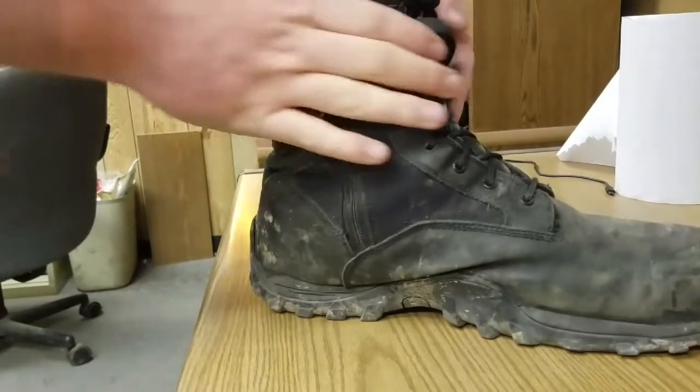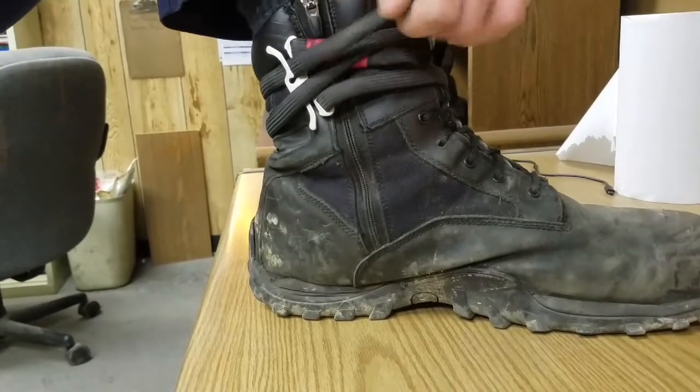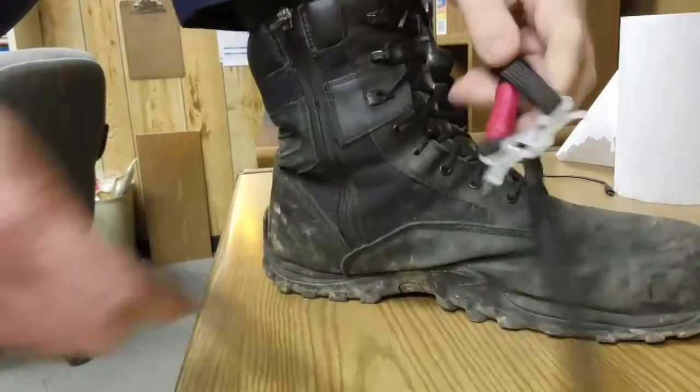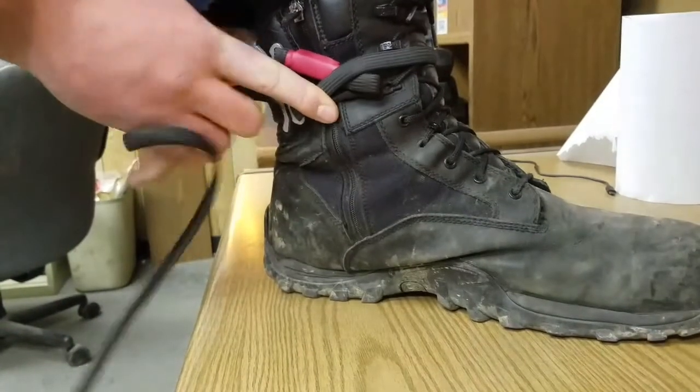For rapid deployment, grab your handle part here, pull it out, and now you've got your tourniquet. You can apply it and do your tourniquet things.